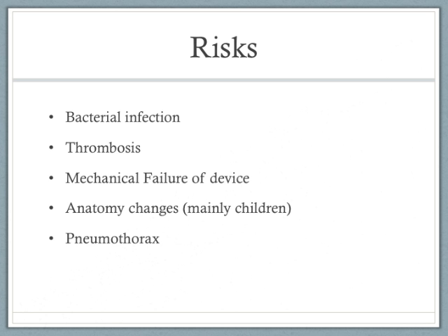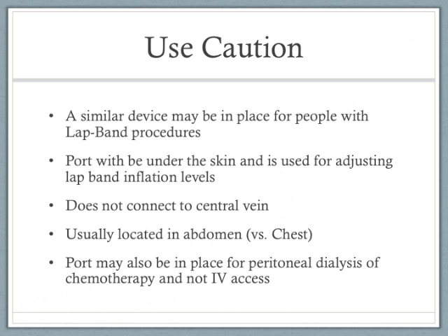The port is not only a device that is used for central venous access. There are also devices that are very similar and look similar that are in place for people with the lap band procedure.